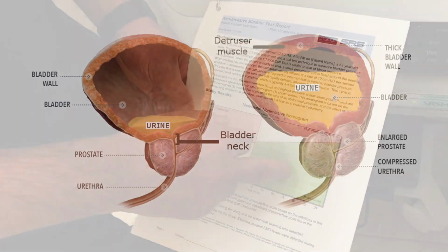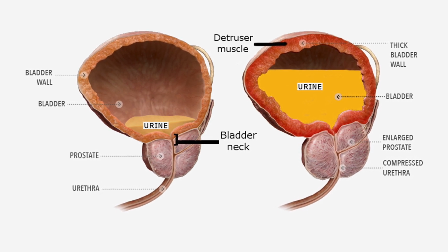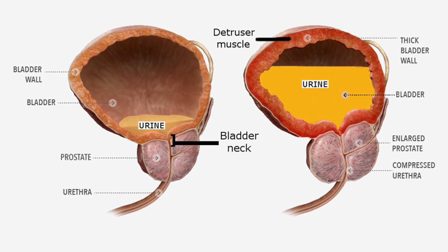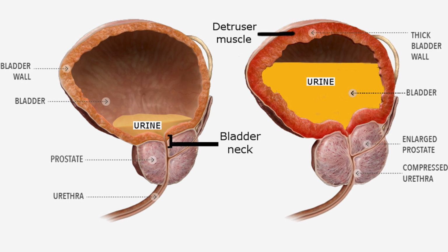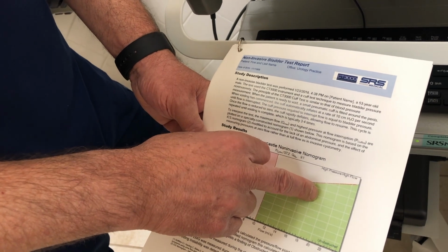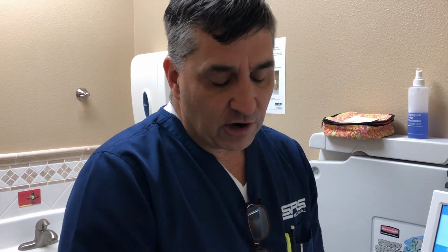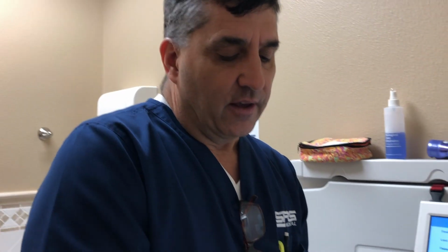Okay, so for most other patients, you're typically dealing with BPH. So it's a matter of what stage are they in with dealing with their BPH. So you may start off with an elevated bladder pressure, however, still here considered to be normal. You would start a medication protocol, and then you continue to manage that patient. Maybe you have a 1-month follow-up, to see how he's doing on meds, to see if your bladder pressure has changed as a result of BPH medications.